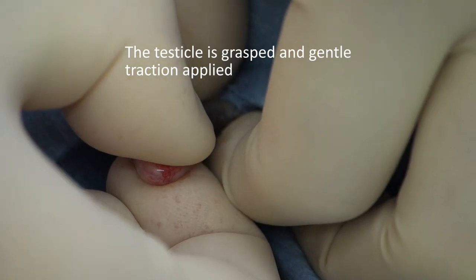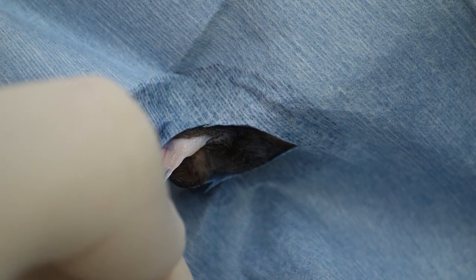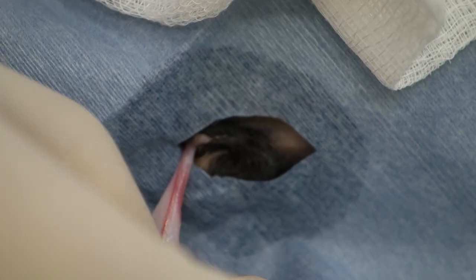We're now putting gentle traction onto the testicle to pull it free from the subcutaneous attachments. Often you'll get a little piece of fat attached to the spermatic cord, and we're just using a piece of gauze to remove that.